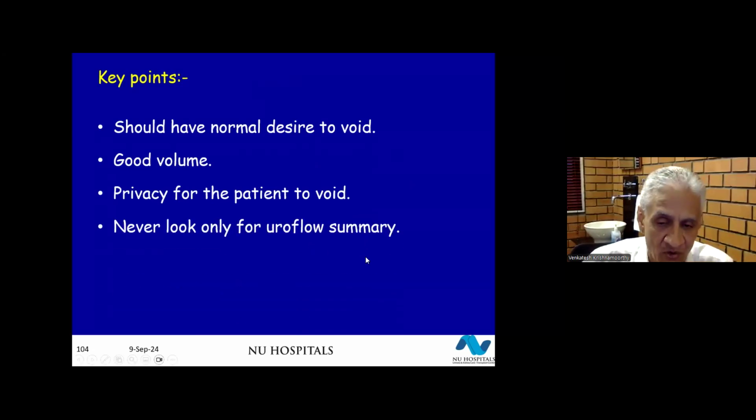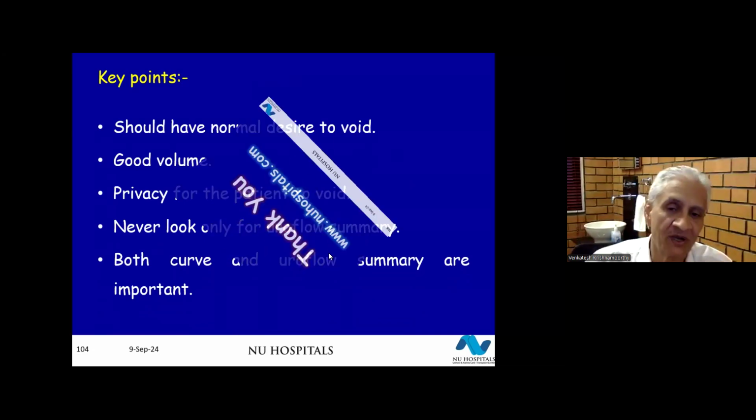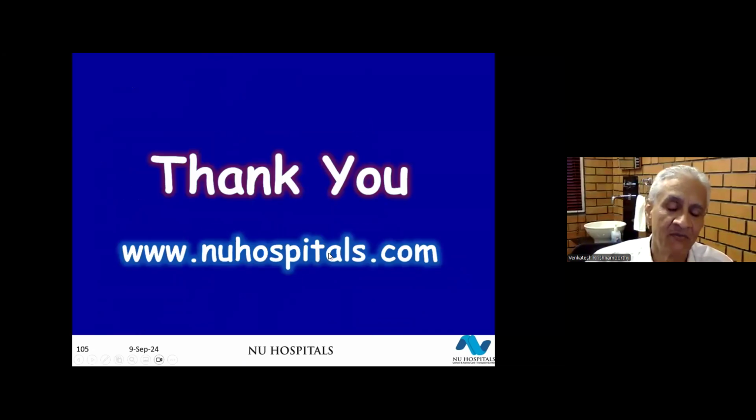Never look only for the uroflow summary. As I've pointed out, there are so many variations in the curve. Both the curve and the summary are important for you to arrive at some kind of conclusion about the patient's probable problem. Thank you.